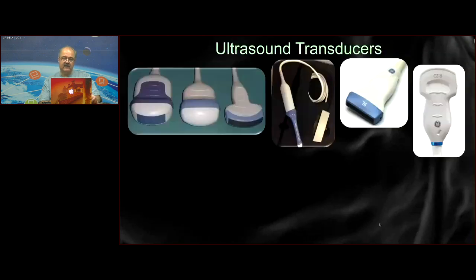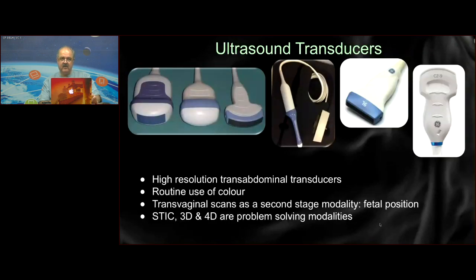Remember that technology is of great use, like in any other part of fetal ultrasound. Once upon a time, life was simple and we used one single transducer like this one, but we've come a long way. We do realize, and this was the first of the useful transducers, that with the fetus with the spine anterior, if we use a linear transducer of about 9 megahertz, we were seeing excellent delineation of fetal kidney anatomy. Truly working very well.